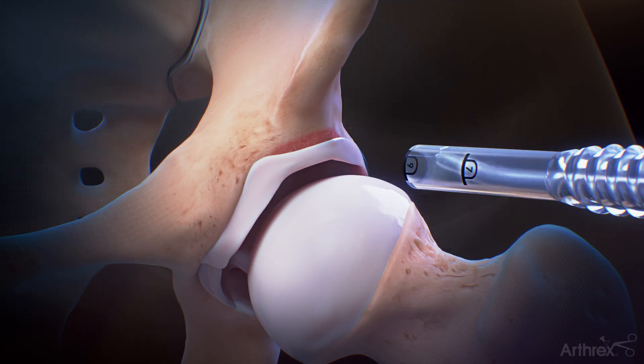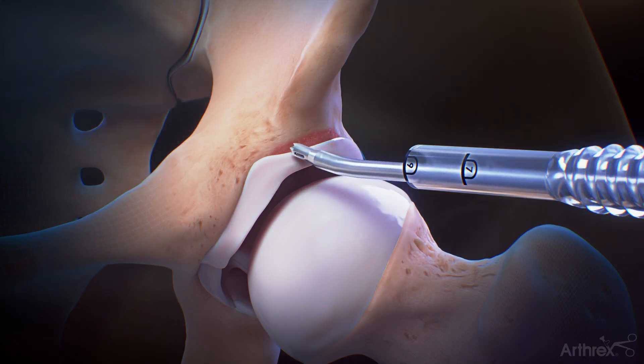Insert a curved suture tack drill guide through the cannula and place it along the acetabular rim. Use a 1.9 mm flexible drill bit to create a socket for anchor insertion. Drilling options include straight, 12, 16, and 20 degree angles.